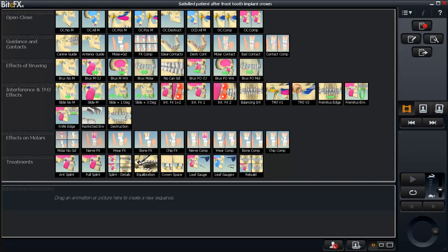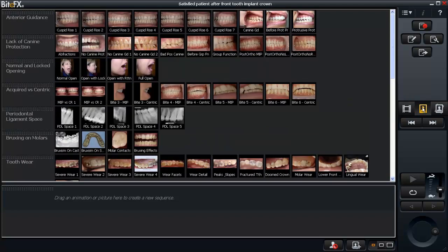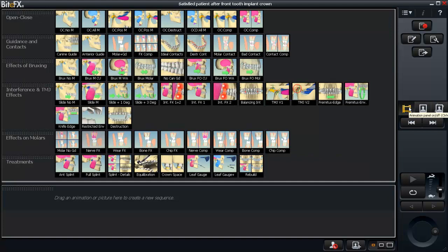So let's get started. When you install BiteFX, this is the screen you'll see. It consists of animations — there are 60 animations. We'll be producing about one animation a month based on our customers' desires to have new animations related to occlusion, and it consists of a series of photographs. The photographs are reached by pushing this picture panel, and the animations are reached by clicking right here. So you have animations and pictures.